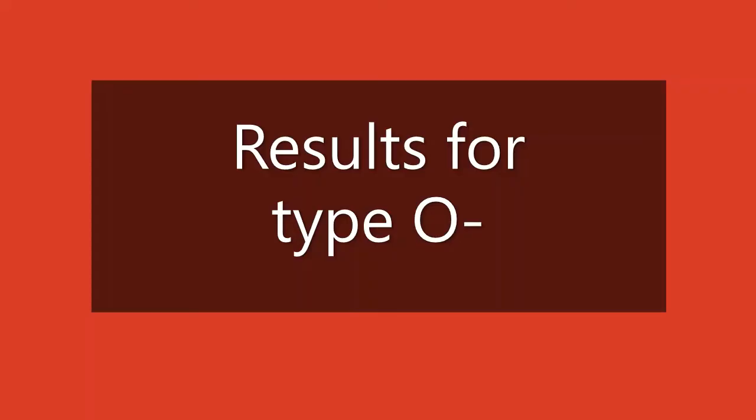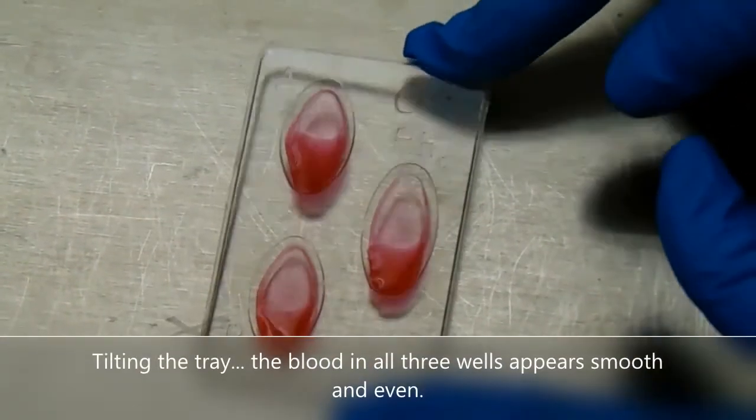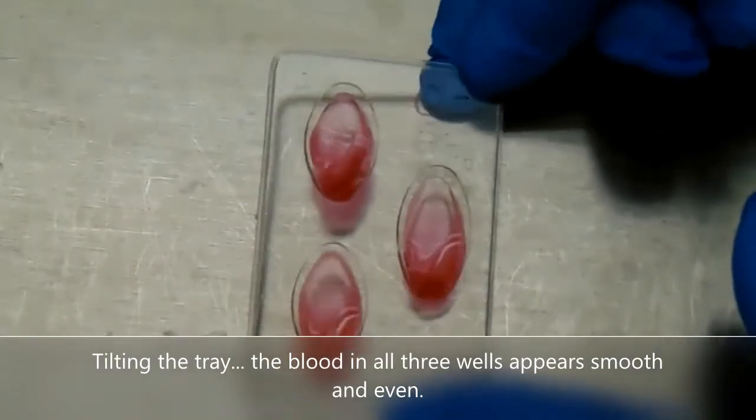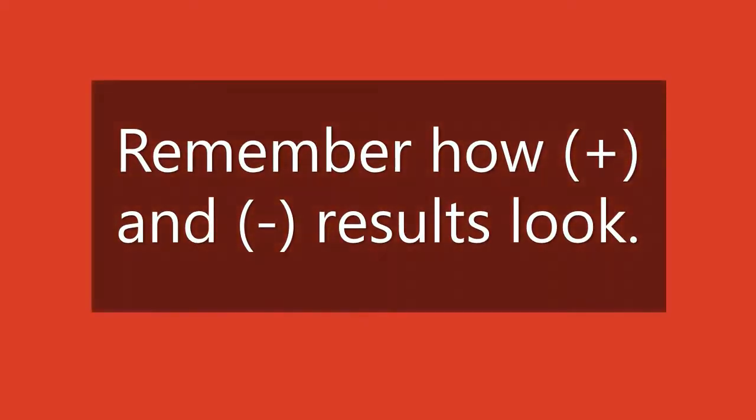Results for type O negative. Tilting the tray, the blood in all three wells appears smooth and even. Remember how positive and negative results look.